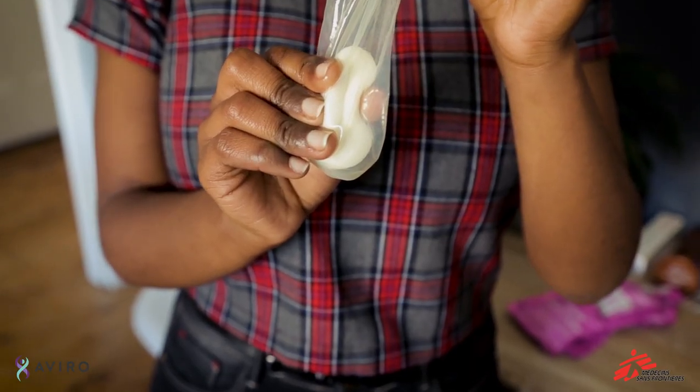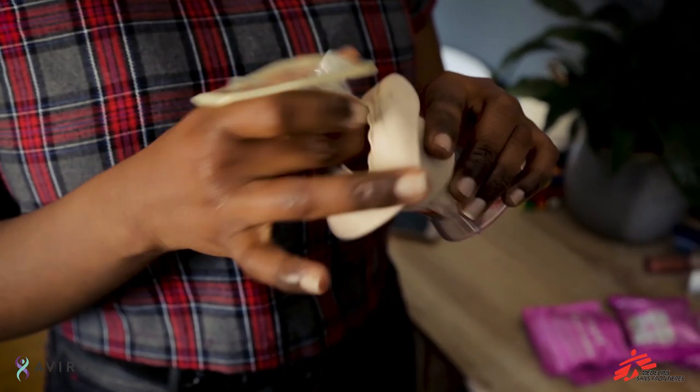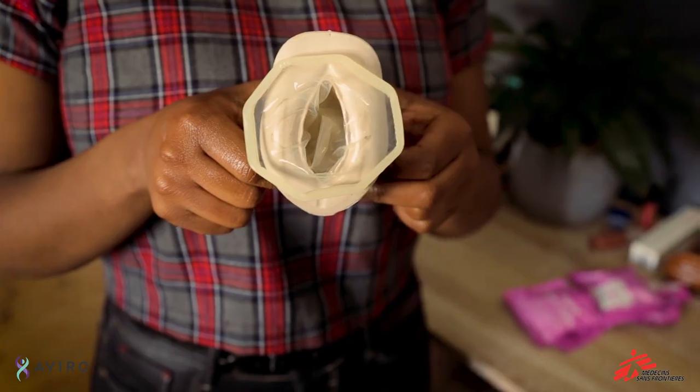Now squeeze the sponge and condom at the top to make it long and guide it into your vagina. Once it's inside, use your finger inside the condom to push it into place as far as it's willing to go. The outside ring will sit on the outside around your lips. When you and your partner are having sex, make sure he goes into the female condom and not on the side of it.